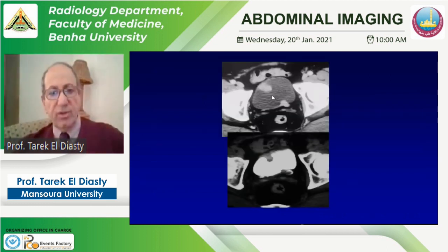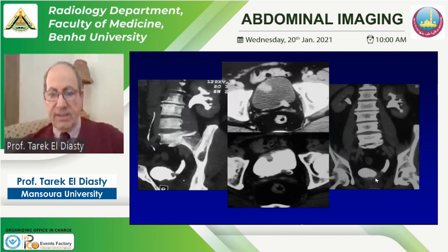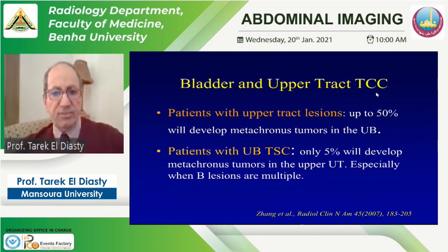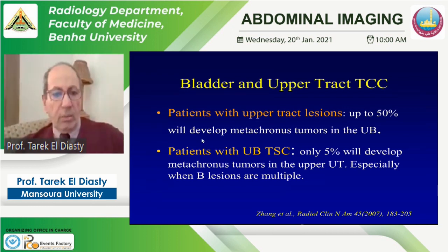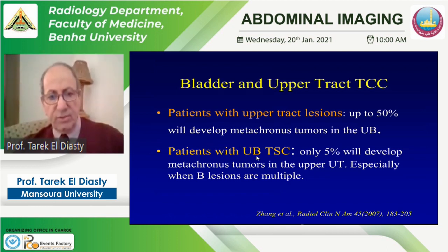An example of bladder tumor on CT urography: an enhancing lesion at the left ureterovesical junction, with soft tissue filling defects on delayed scans and a filling defect of the tumor on coronal CTU. Regarding the relationship between bladder carcinoma and upper tract transitional cell carcinoma: when a patient presents first with an upper tract lesion, up to 50% will develop metachronous tumor in the urinary bladder, while in patients with bladder TCC, only 5% develop upper tract metachronous tumor. Therefore, strict follow-up is required for upper tract presentations.